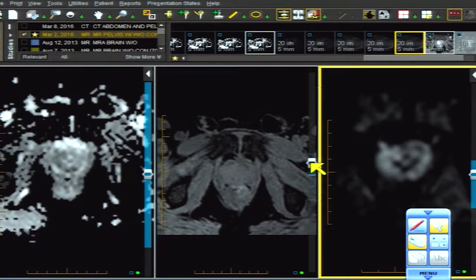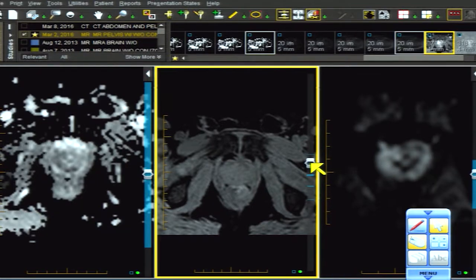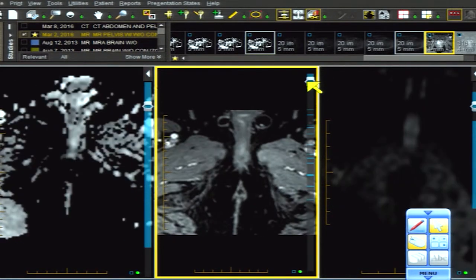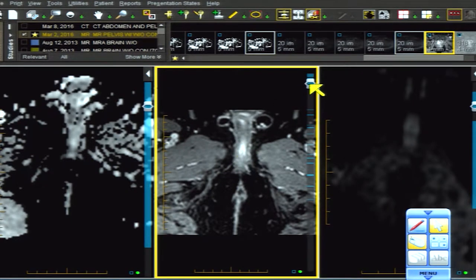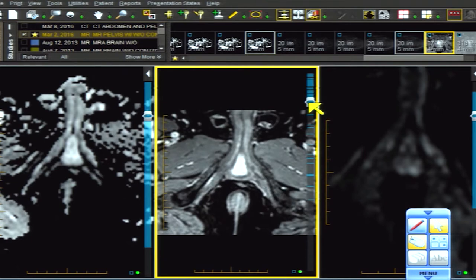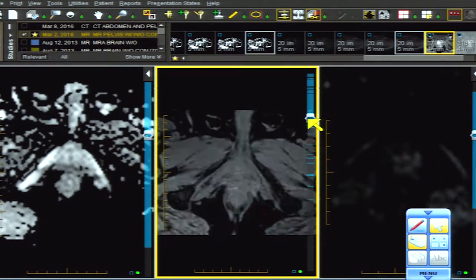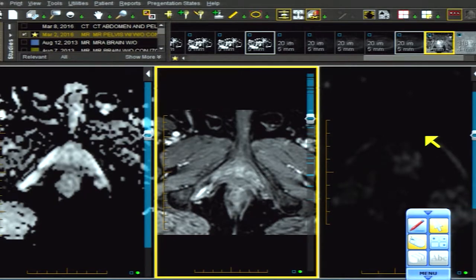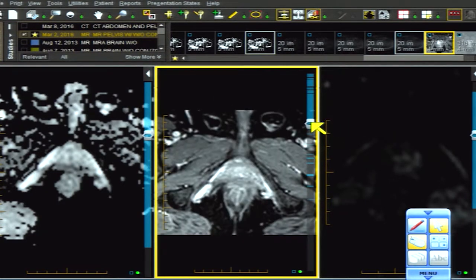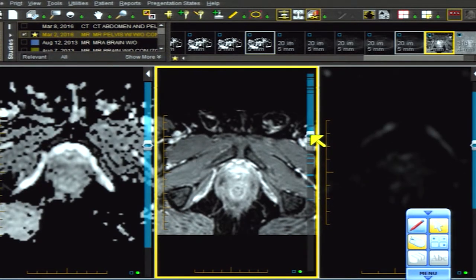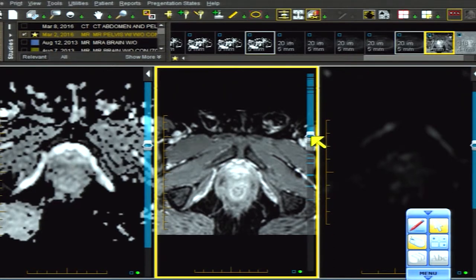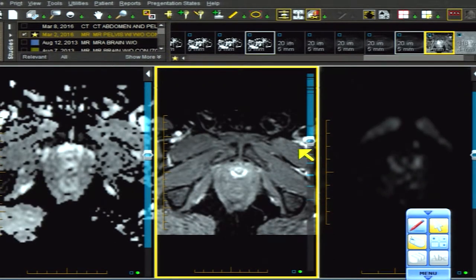I'm going to show you the DCE MRI. Let's start all the way at the apex of the prostate, near the base of the penis, and work our way from apex to base. On the viewer's right we have diffusion, on the viewer's left we have the ADC map. Watch the bouncing ball as we work our way up — there's the rectum, there's the urethra.